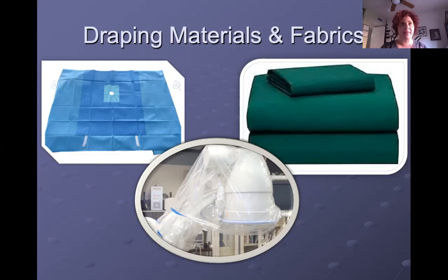So these non-woven drapes are not 100% strike through resistant. If fluid sits on them long enough, it will soak through to the underneath. And when that happens, that leaves a pathway for bacteria to move from non-sterile onto our sterile surface, and that's not a good thing. So if something does get spilled, whatever, there's blood, maybe we want to dry that up real quickly if we can.